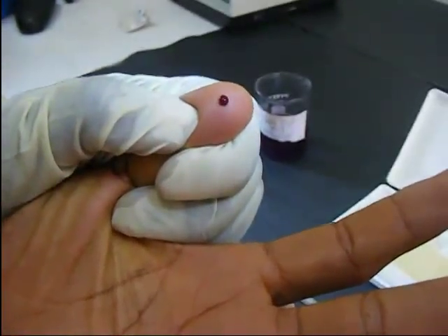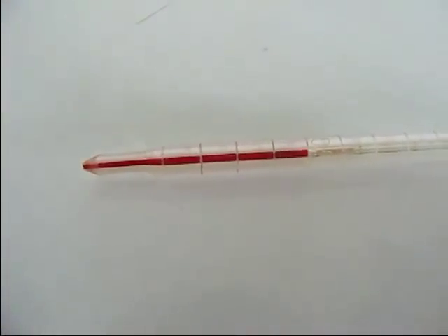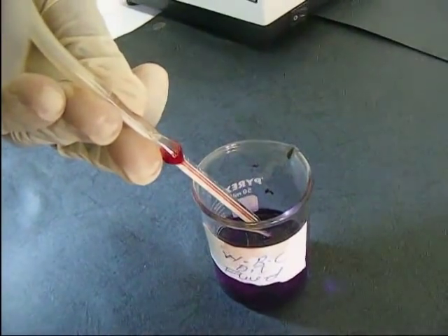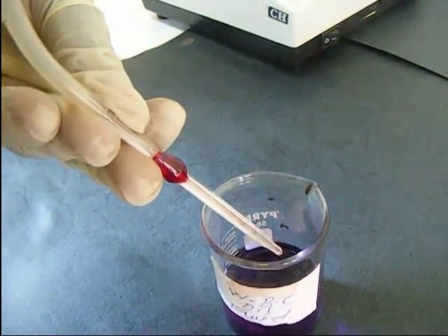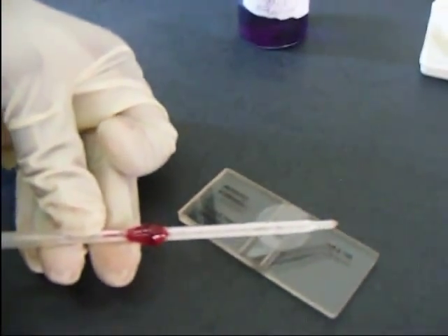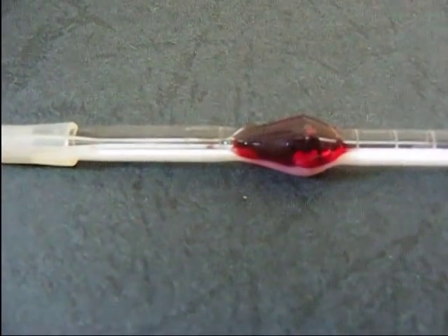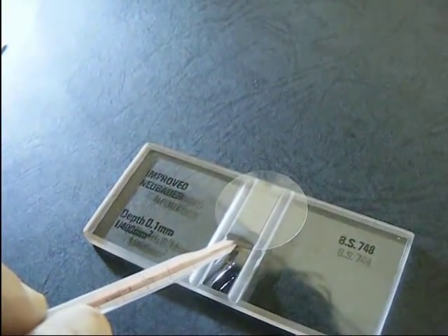The lancet is used to prick the tip of the thumb and the blood is pipetted with a white blood cell pipette and brought to the 0.5 mark. The pipetted blood is then diluted with a white blood cell diluting fluid to the 11 mark. The counting chamber is then filled with the diluted blood.